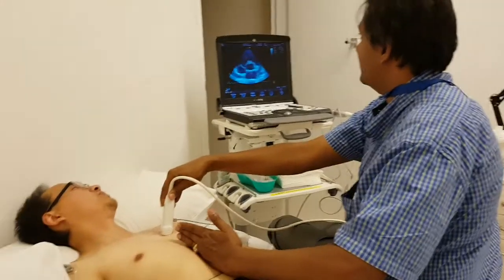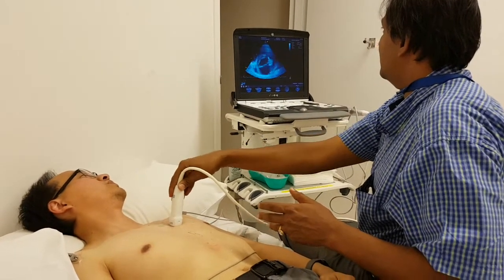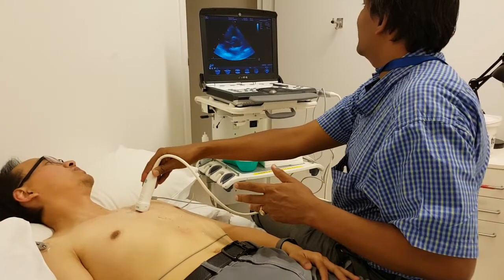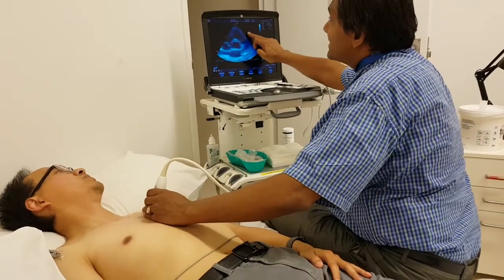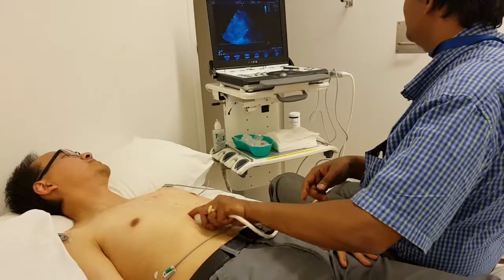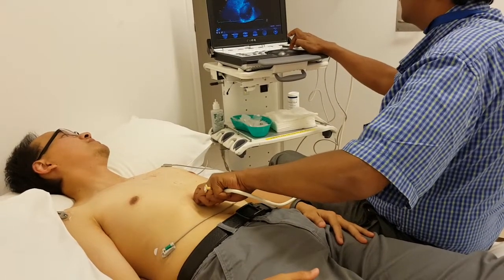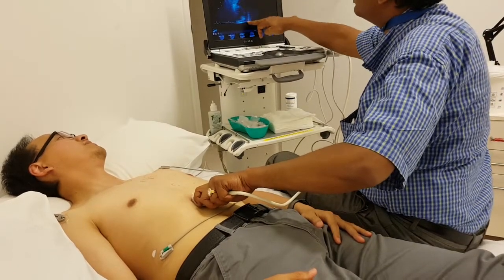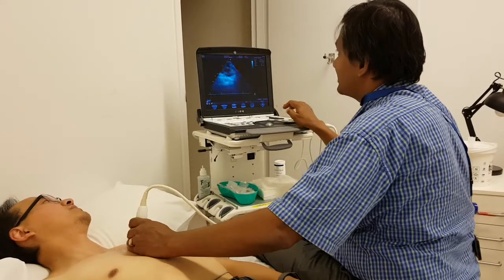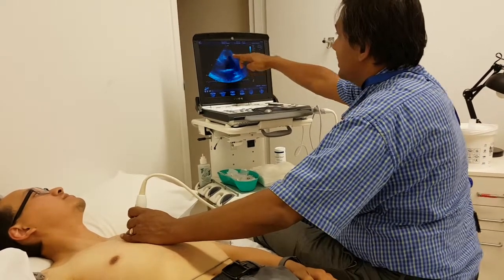I'll try rotating the probe to see if I can get the pulmonary artery better from the parasternal. This is the mitral valve view, now the aortic valve — but here I'm not able to get it as well because you can see the lung is coming in laterally. From the subcostal we could get a much better pulmonary artery view because there was no interference. From here you can see the pulmonary artery beautifully, but from the parasternal the lung is coming into view and creating A-lines.